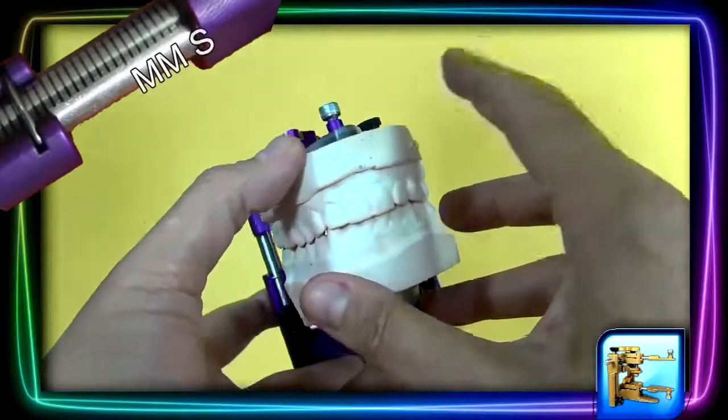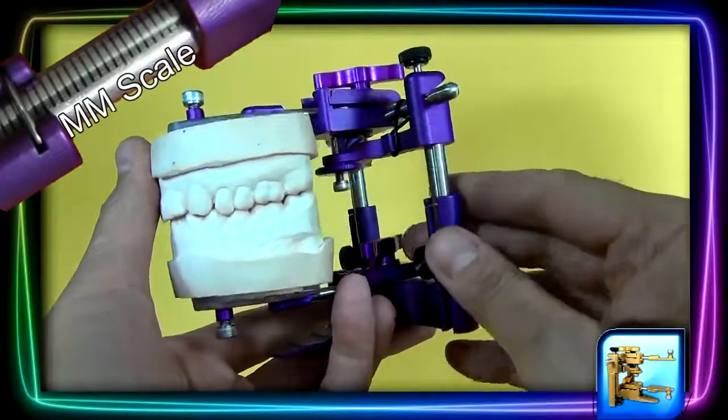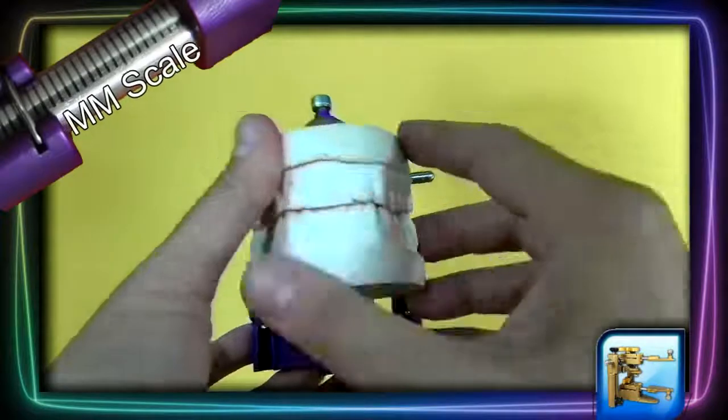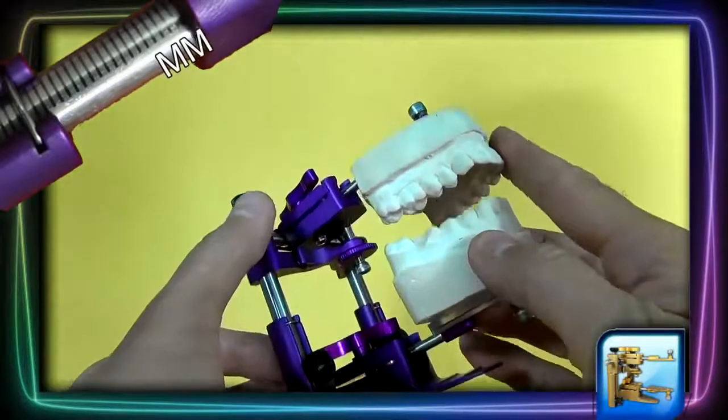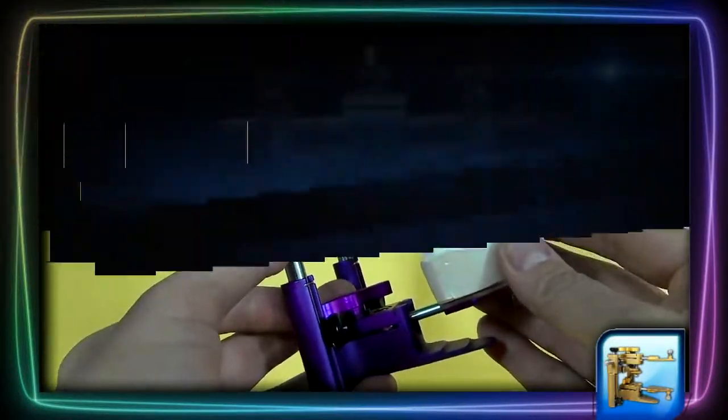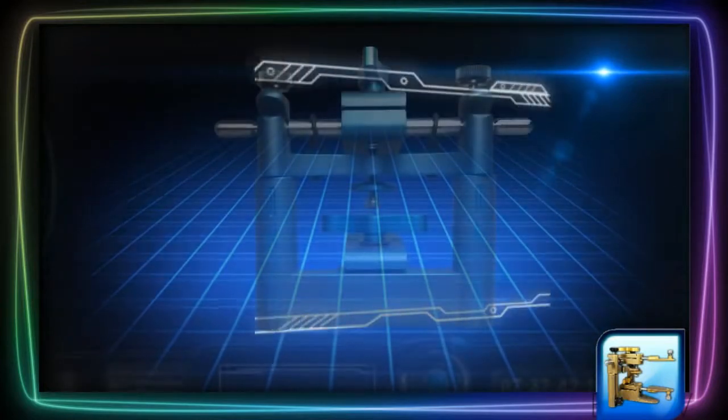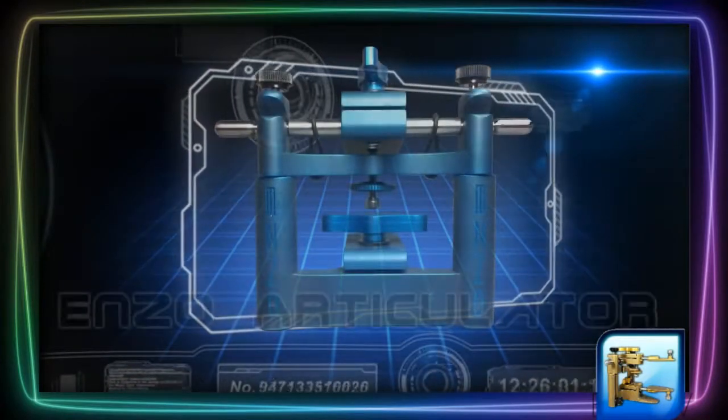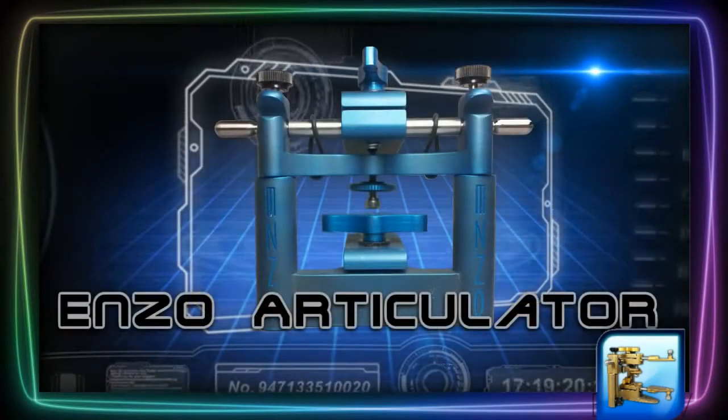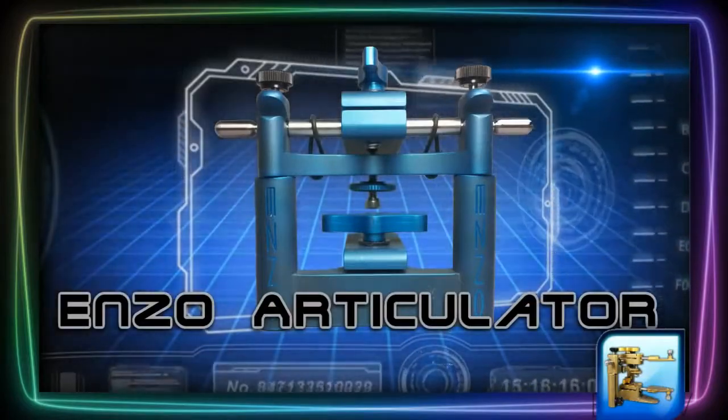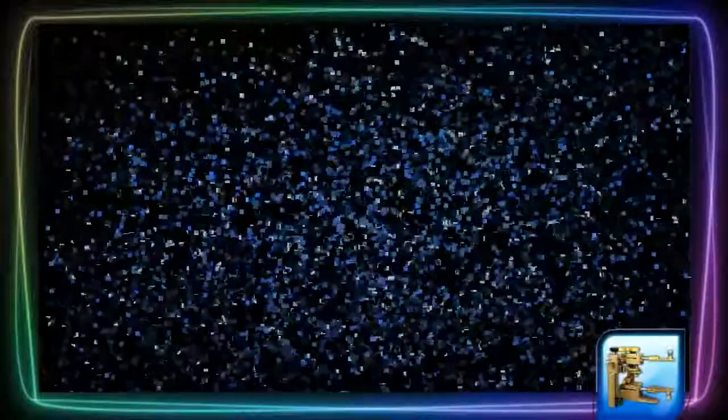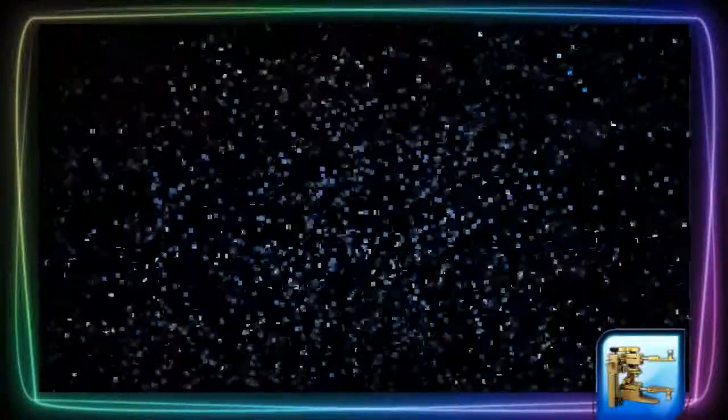Another nice feature of this articulator is the millimeter scale on the vertical rod. And we're done. As you can see, it's pretty simple. It takes seconds and is extremely accurate.